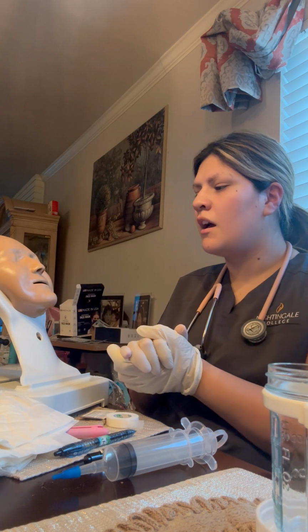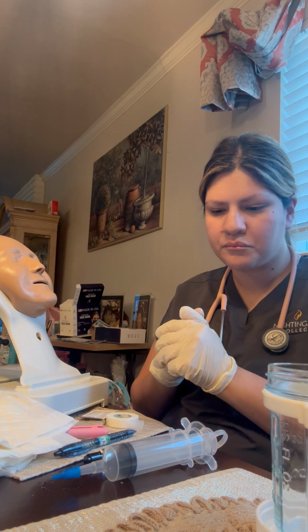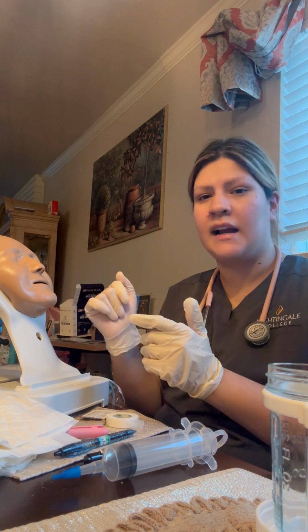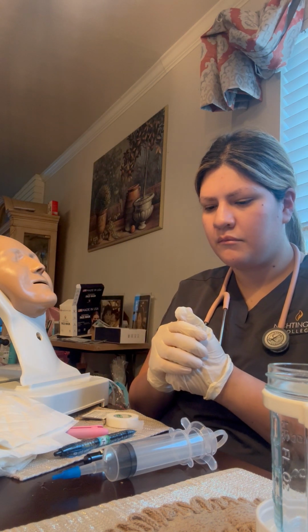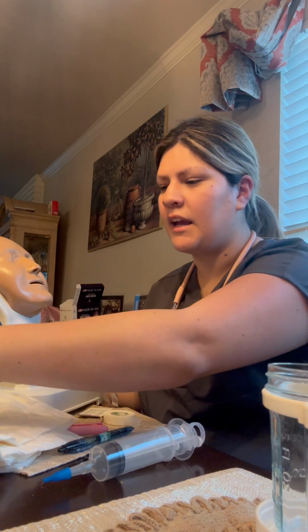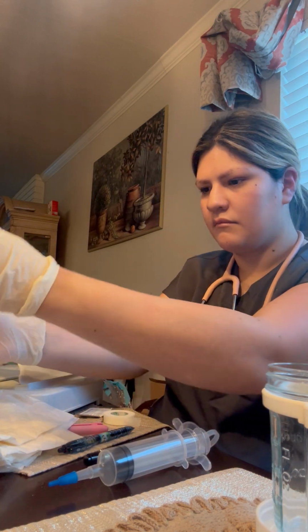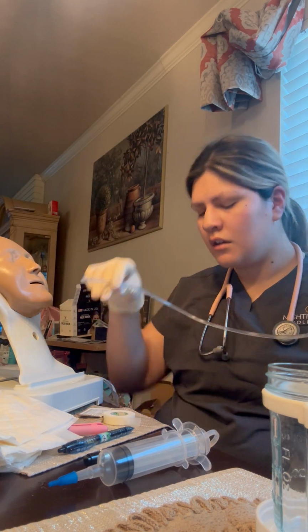Perfect. So in this scenario, I'm going to go ahead and choose the left side as it's a little bit stronger. Okay, so I'm going to go ahead and take my tube, and we're going to go ahead and measure.